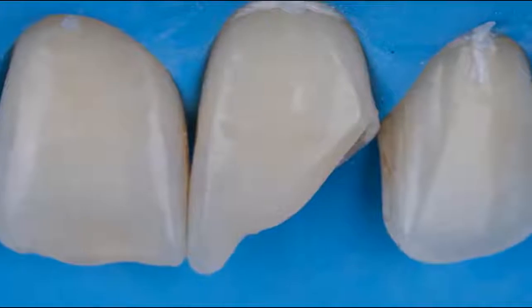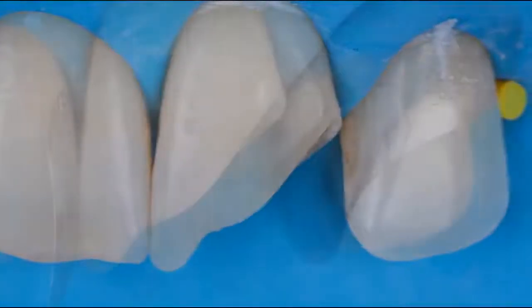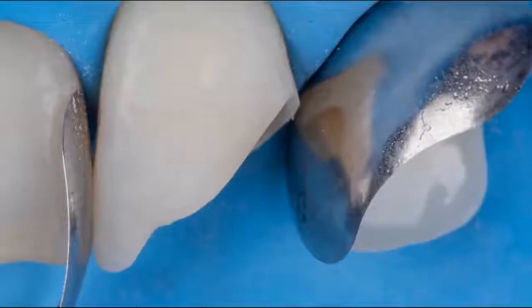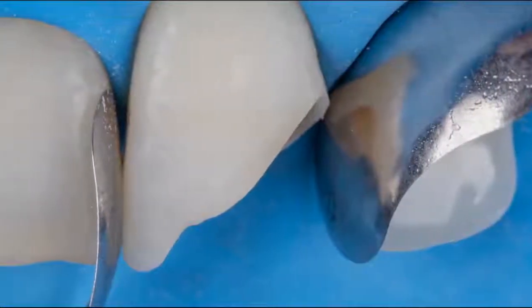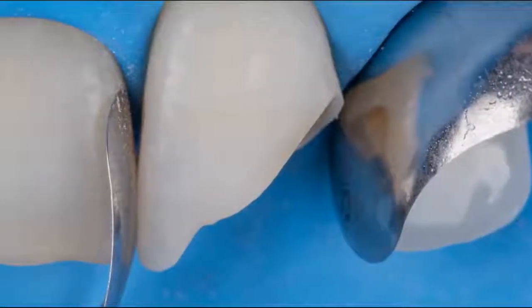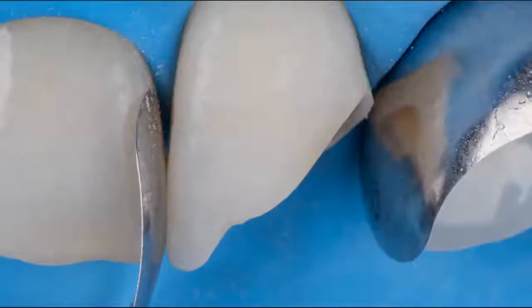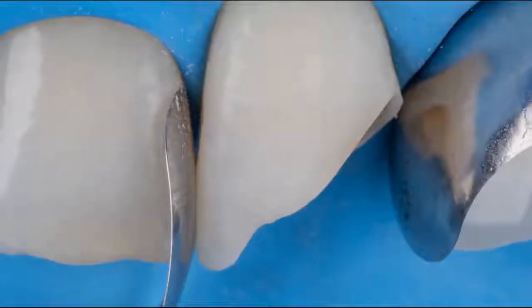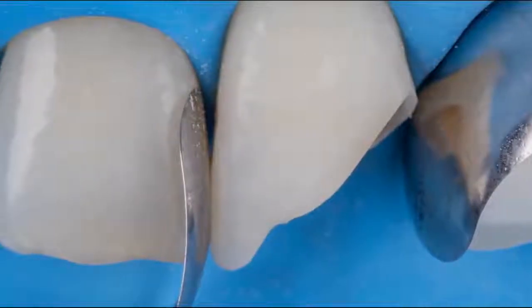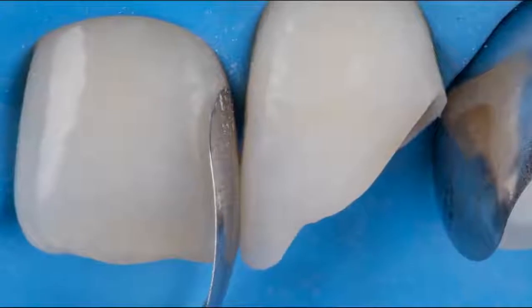Here you can see the view after the preparation and isolation stages, and also after sandblasting of dental tissues with powder of aluminum oxide with a particle size of 27 microns. I strongly recommend you use sandblasting of dental tissues because this kind of influence may lead to many positive features and can really help us to intensify the force of adhesive connection.